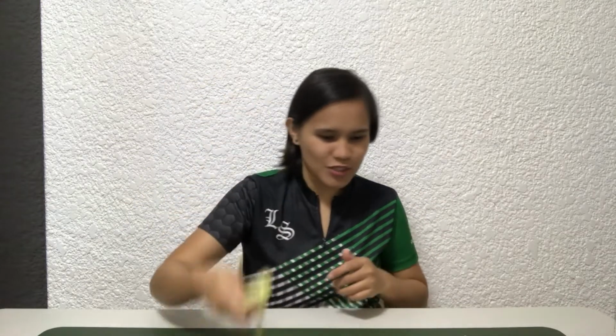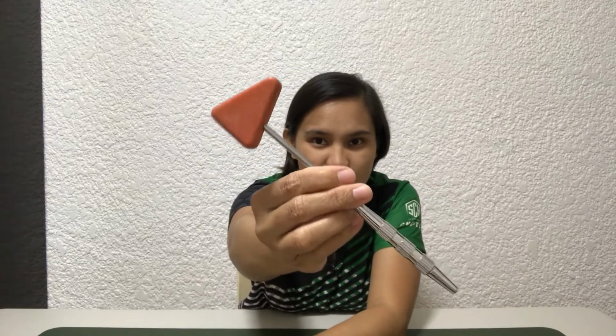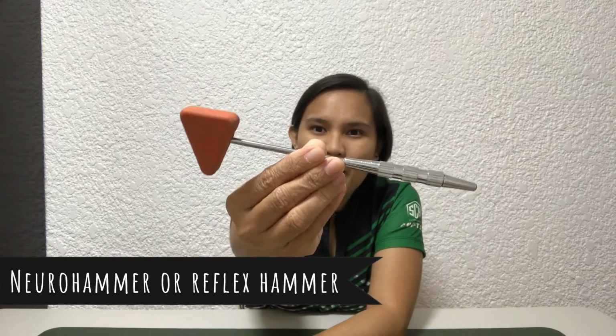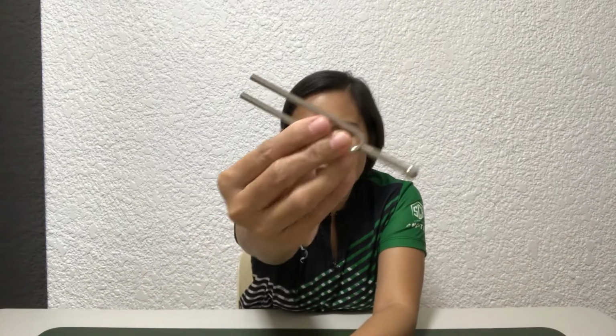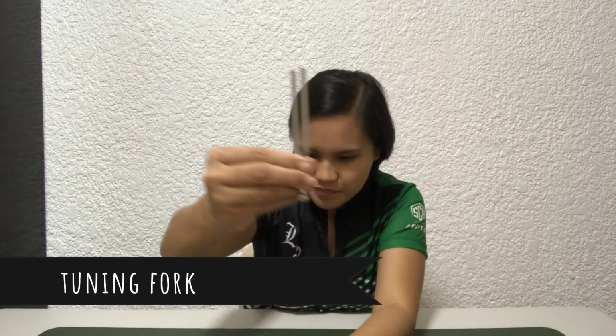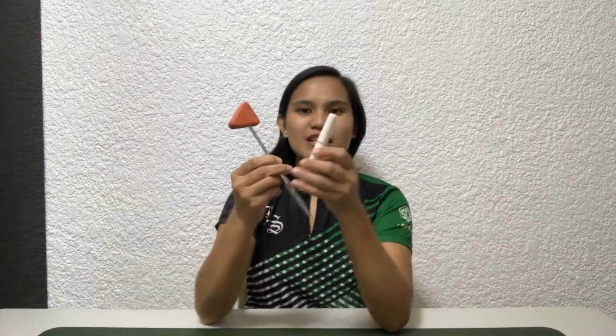Okay? So, tape measure. Now, the next tools that I have here are these three. If you could see, this is a neurohammer, or we also call this the reflex hammer. And then I have here the tuning fork. And then I have here the pen light. So these three tools are used for neuro assessment, specifically for neurological cases.